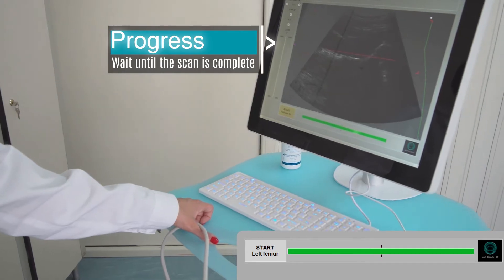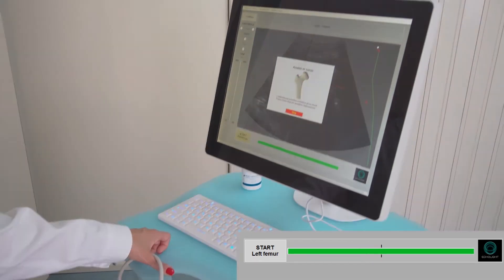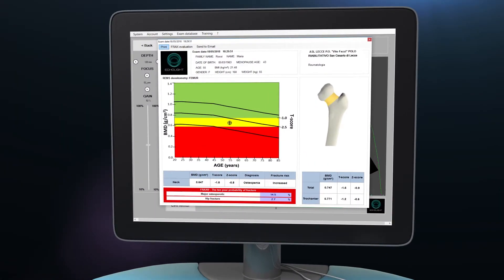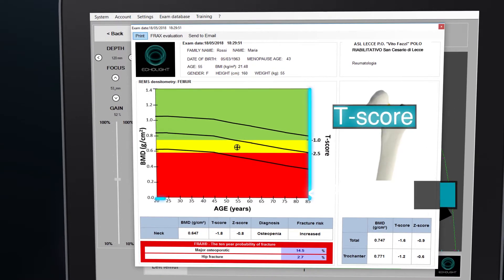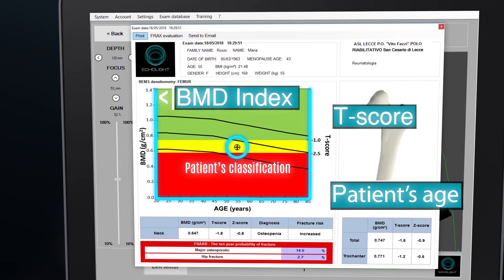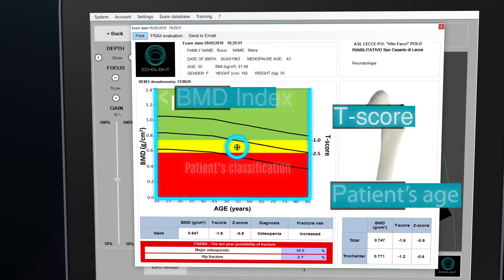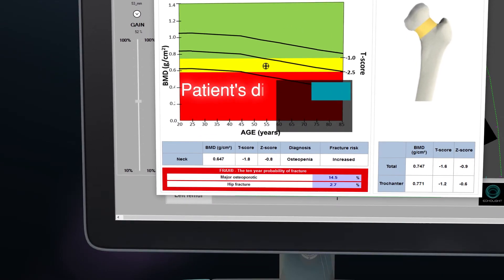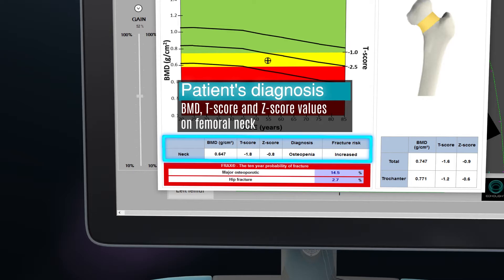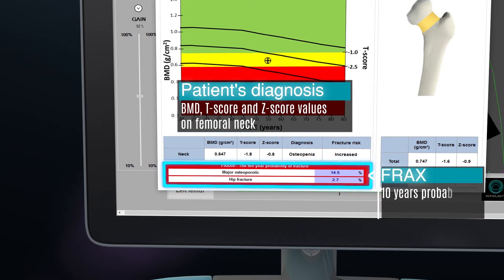Data analysis is totally automatic. After a few tens of seconds, the medical report will be displayed on the screen. A mark displays the patient's position on the graph and their BMD and T-score values according to their age. The BMD, T-score and Z-score values of the femoral neck and the relevant diagnosis are displayed on a chart. The 10-year probability of fracture is displayed at the bottom of the medical report.